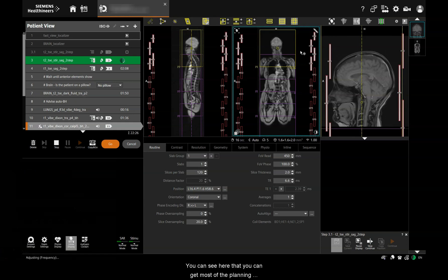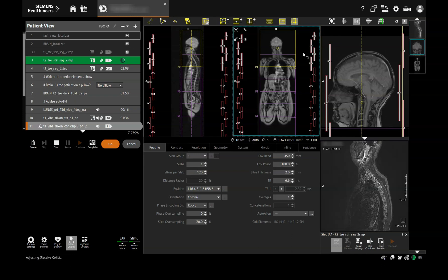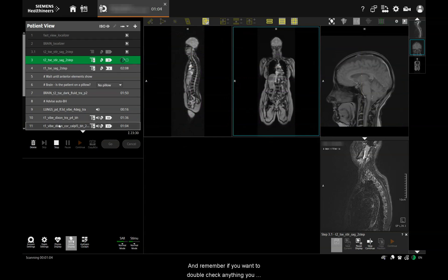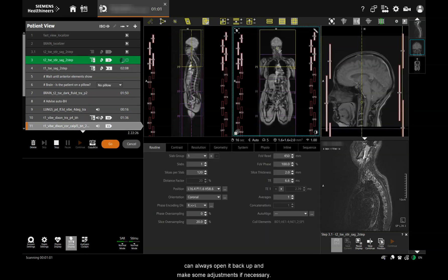You can see that you can get most of the planning done before the first spine series has reconstructed, which gives you plenty of time to look through your images later. And remember, if you want to double check anything, you can always open it back up and make some adjustments if necessary.